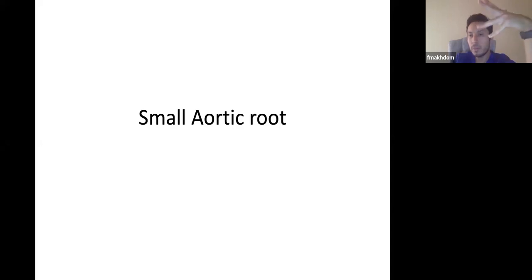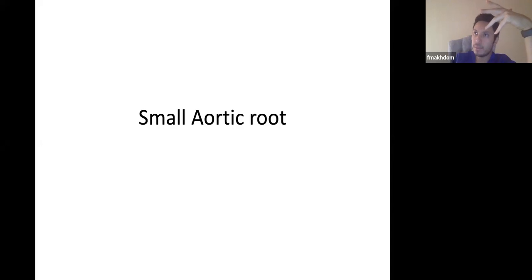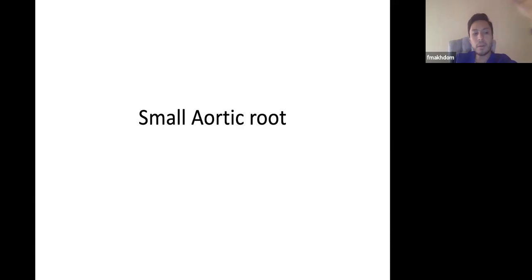You can tilt the valve. You can put the valve tilted, or even put the suture from outside, from the non-coronary area, just to reduce the sutures. So it might help. Or accepting the patient prosthesis mismatch, given the patient's age, but she's active, so it's better to do something about it.